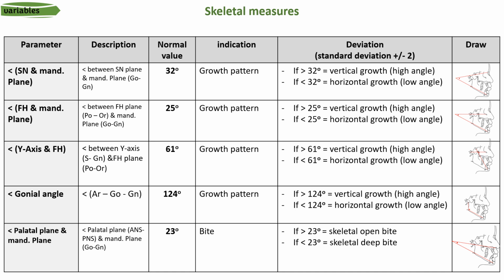Because sometimes you should know that not every vertically growing face will have an open bite, and not every horizontally growing face will have a deep bite. Of course not. Sometimes it can be both, and sometimes it can be either skeletal or dental.